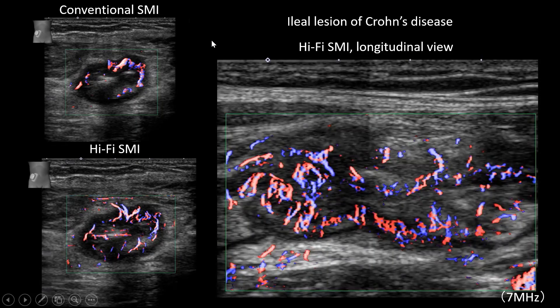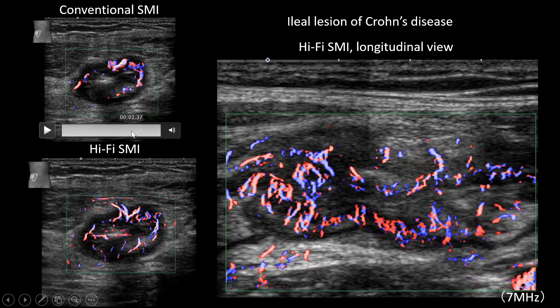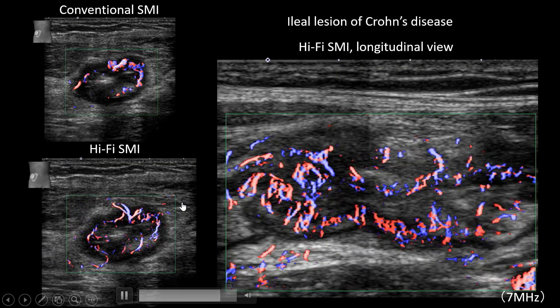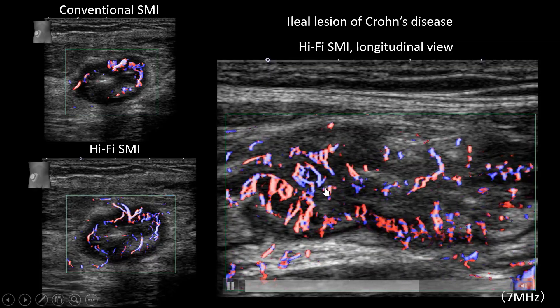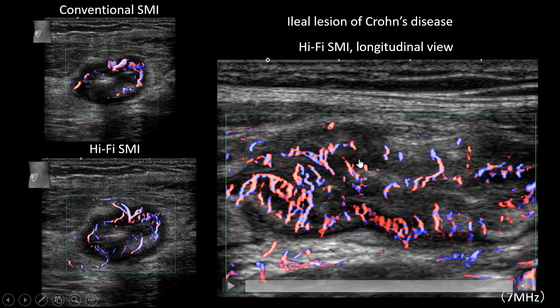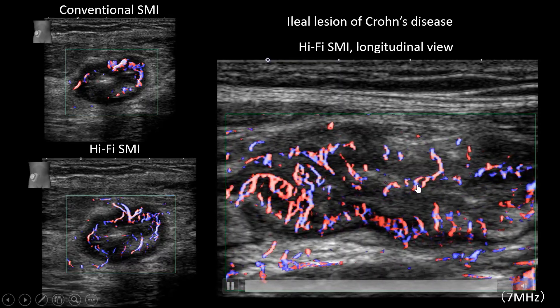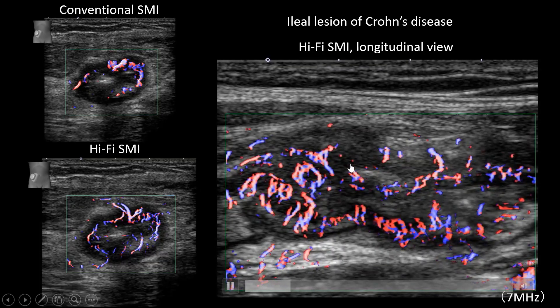This is ileal Crohn's disease. By conventional SMI you can see the intramural blood flow. Hi-Fi SMI shows many more vessels. In this longitudinal view of the lesion, you can see that this portion of the patient's bowel tract has severe inflammation.